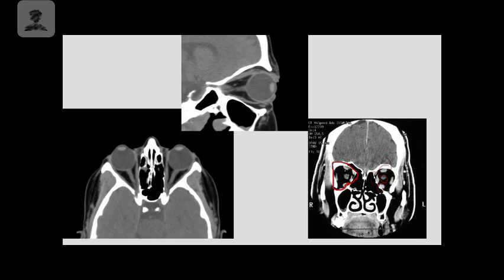I don't like looking at coronals of orbits or facial bones because there usually is going to be a couple slices where it looks like a creepy monkey. And this is what I see here, kind of like a creepy monkey. But it is a good view to look at the muscles and identify if there's any kind of fractures that are protruding down into the space. If there's any kind of additional blood, there's a lot of good things for the coronal view.